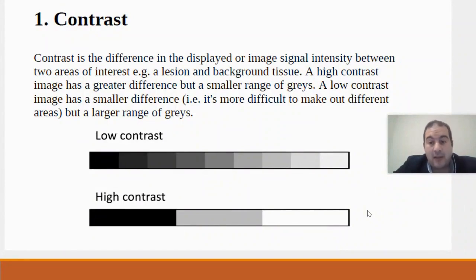However, if there is a stone present in the kidney, the stone is considered an object that provides a high bright signal, while the kidney serves as your background. In this case, there is a big difference, resulting in high contrast between the stone and the background. The process of obtaining the contrast present in the image honestly has many factors that affect it.